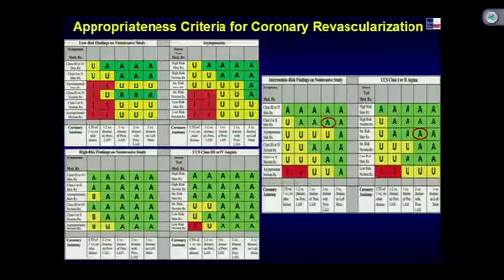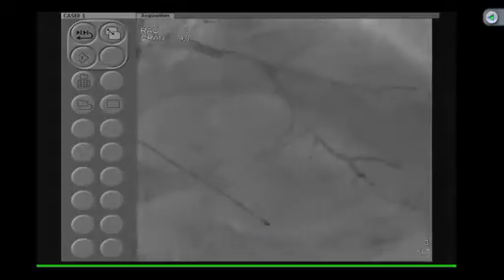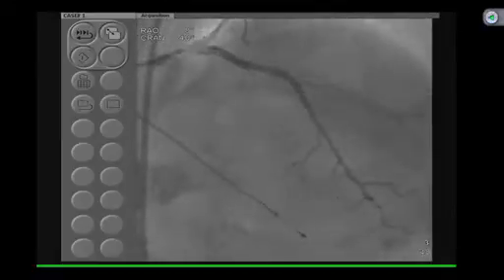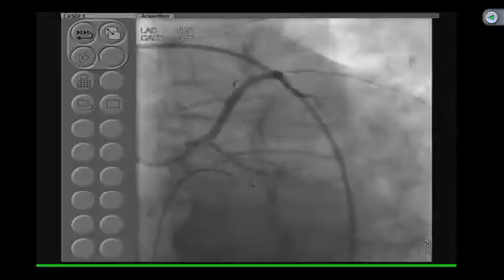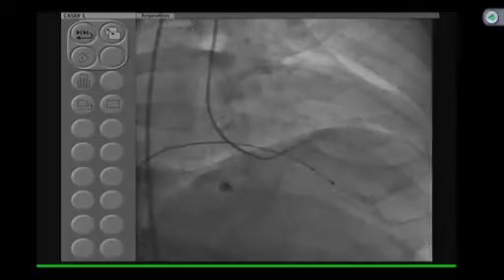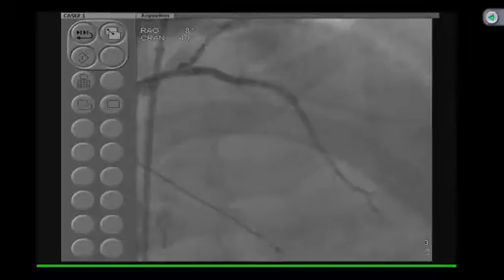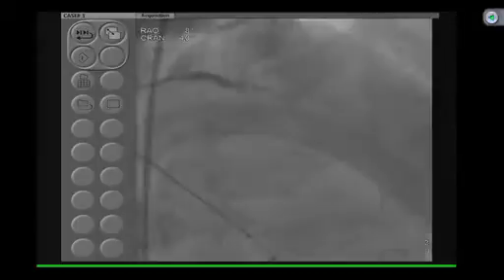Anu, you want to take us through the angiogram? Yeah. So you see the left main is non-obstructive, and the LAD PCI site looks okay. Distally there is a lot of disease in the apical LAD, and the circumflex is majority non-obstructive. OM is okay, but there is diffuse disease of a small size LPL. And this is the LV gram. Anu, the diagonal looked exactly the same way before? Yes, a little nicking of the ostium. That was there even in the last angiogram.